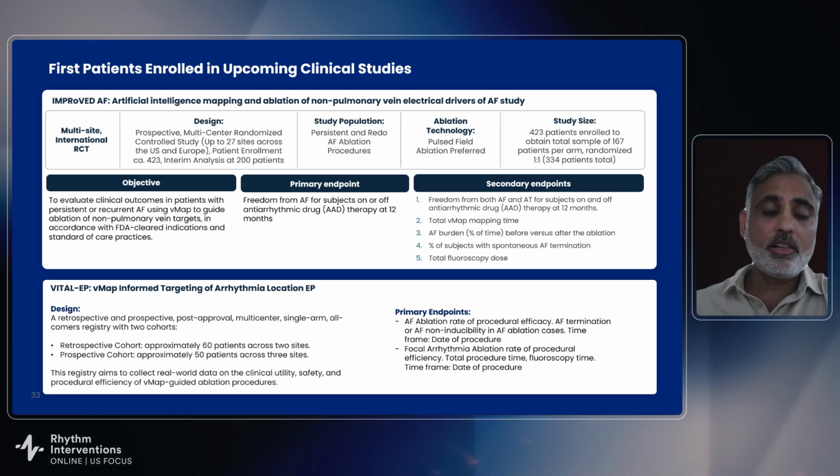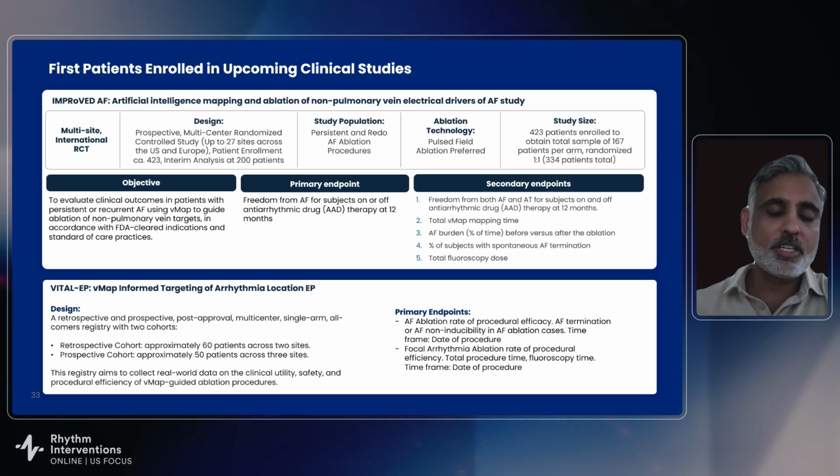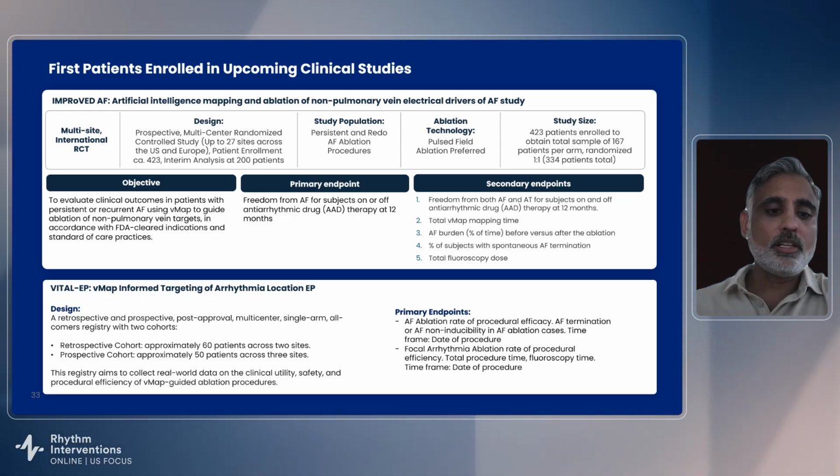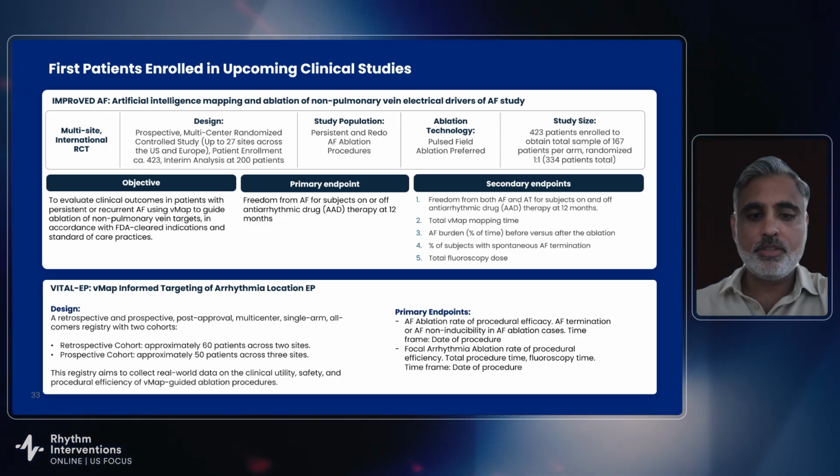We're also finishing up the VITAL EP study, where we're looking at pretty much any arrhythmia and looking at efficiency and real-world clinical utility and safety of this technology.